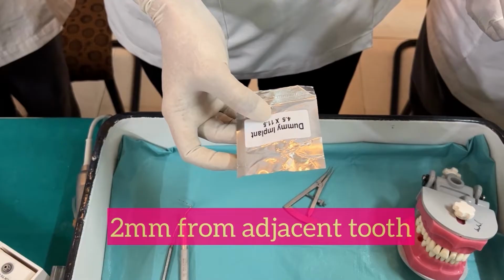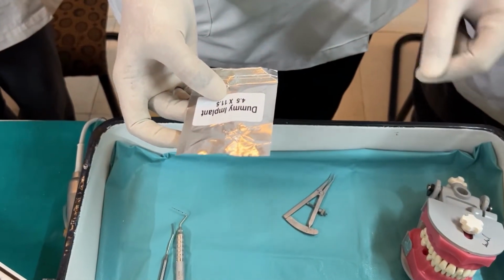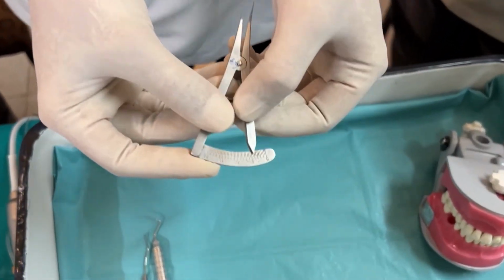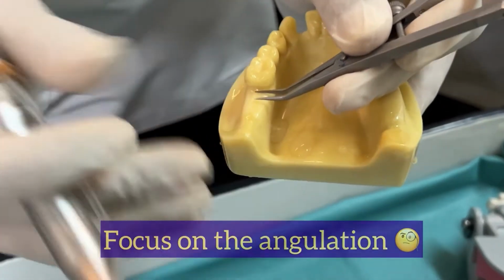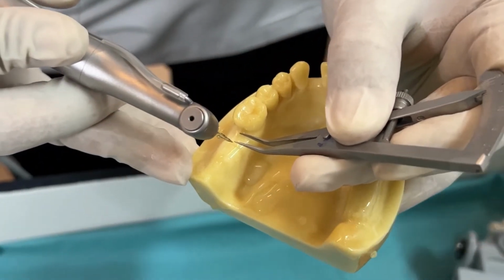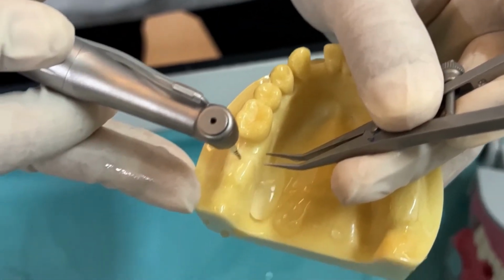It should be 2 millimeter from the adjacent tooth plus 2.5 millimeter of the diameter of the implant. So now I had set it to 4. I'll just increase it to 4.5. It is already 4.5. Angulation we will be following, and this time always and always we have to feel the buccolingual width first, and then roughly in the center of the ridge we will be making a hole like this.